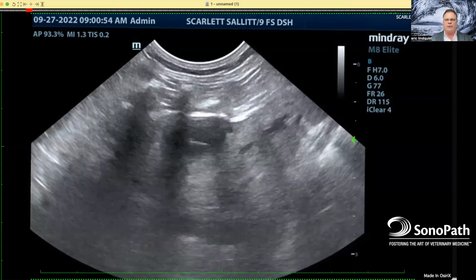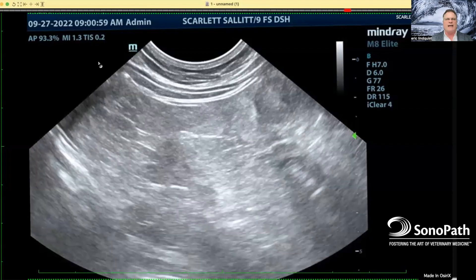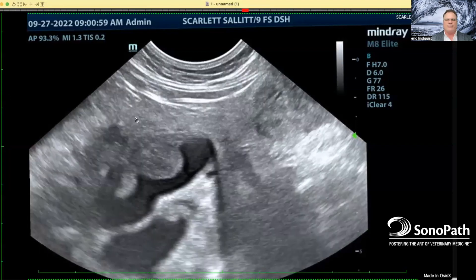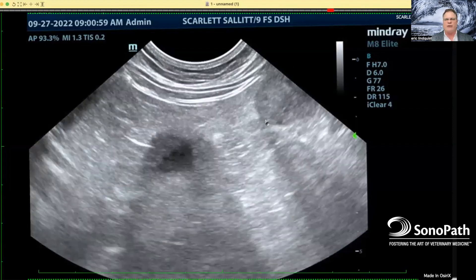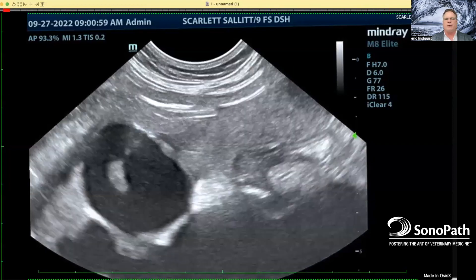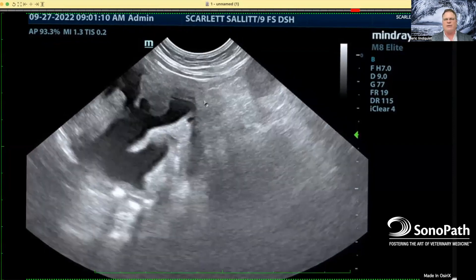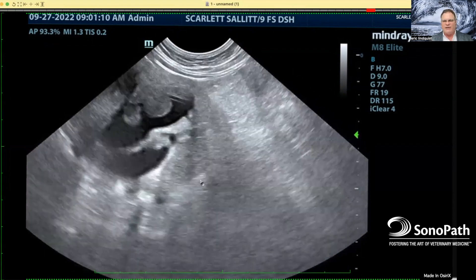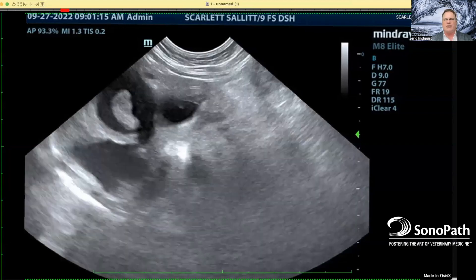As we move forward, the gallbladder is dilated and then you have this biliary mass sitting in this area as well. You can see that this biliary mass — typically carcinoma — is isoechoic to the liver. So when I see these sort of nodules and this sort of scenario, this is a typical biliary carcinoma with post-hepatic obstruction and metastatic changes. You'll get some free fluid between the liver lobes, and you can see all of this dilation leading to a primary mass down at the duodenal papilla.